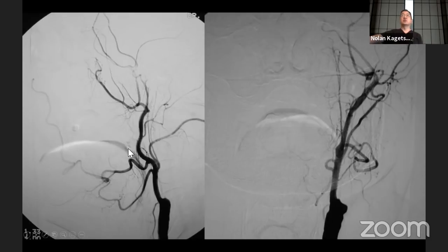Ideally the patient is perfectly still for this subtraction technique to work out. And as you can imagine, it's hard to have your tongue perfectly still for a long time. You just swallow and that sort of thing. And so the tongue moved, and you have this artifact on these images. But that is a hint to what this vessel is. This is the lingual artery. There's two of them, and they come up and don't quite get to the midline. That's why I think that when people get tongue piercings, they get them in the midline, because presumably they don't want to hit the lingual artery.